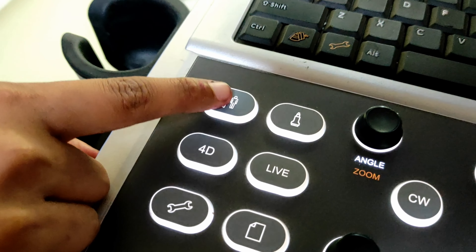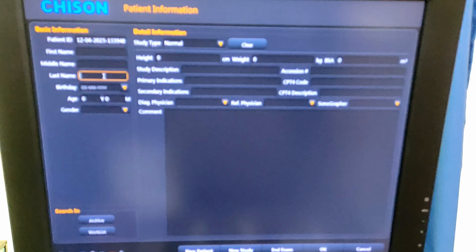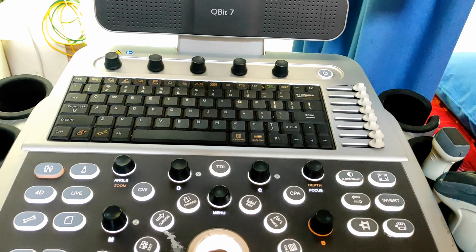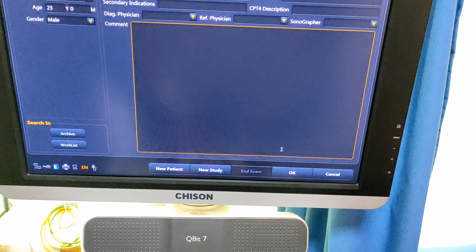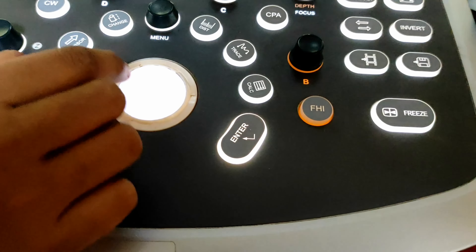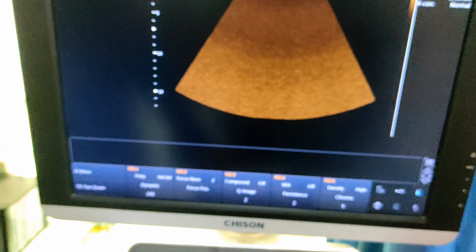This one is the patient button. Press the patient button and see — it will show you the patient information on your screen. Now use your mouse button to place the cursor on OK, and press the enter or OK button to continue the examination.